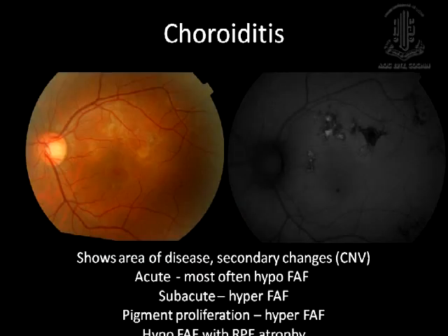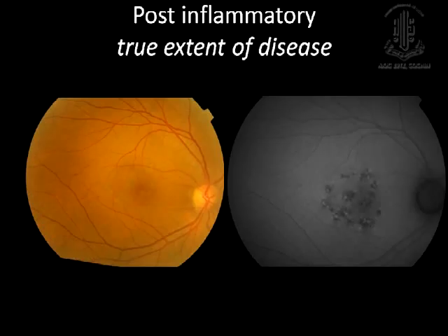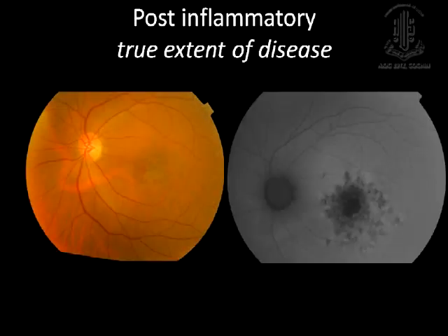In choroiditis, it helps us to diagnose the extent of the disease much earlier. And as you can see here, the color photo does not reveal the true extent of the disease, but here it does reveal the true extent of the disease.